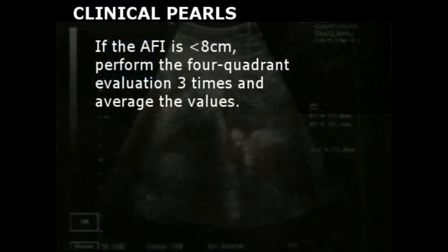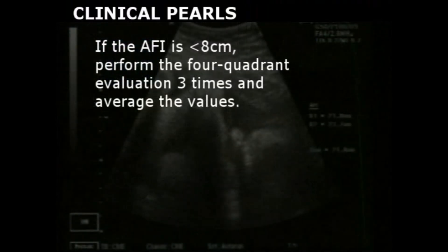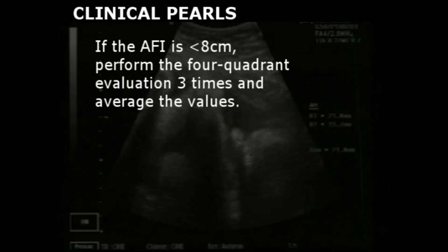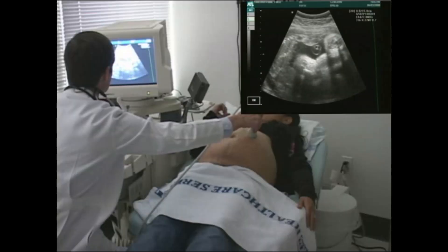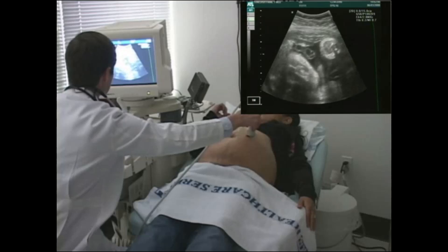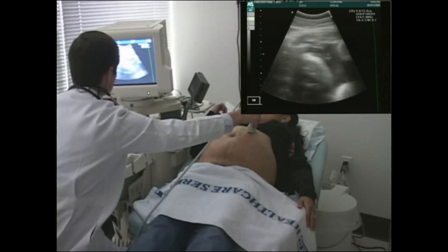If the sum of the AFI is less than 8, perform the four quadrant evaluation three times and average the values. If there has been difficulty imaging the fetus, the amount of fluid is probably reduced.